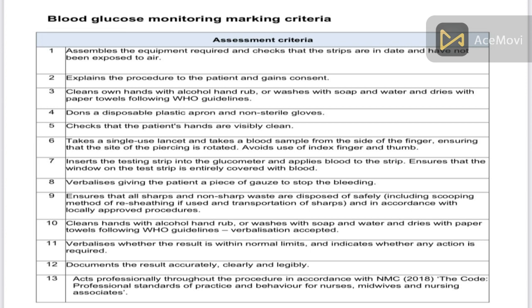I am here to administer your insulin. Is it okay for you? People may ask questions about your insulin and about the proper patient identification — such as your age and your name.